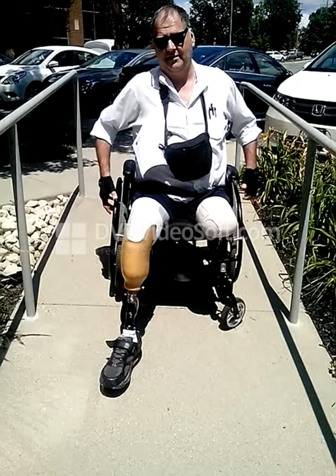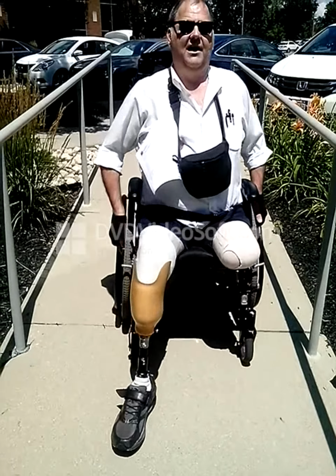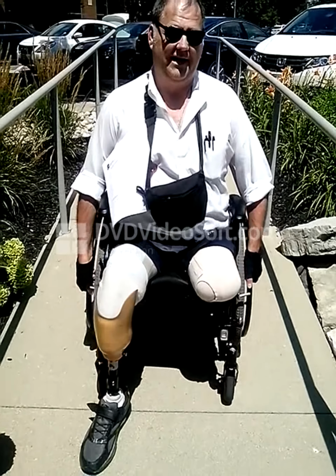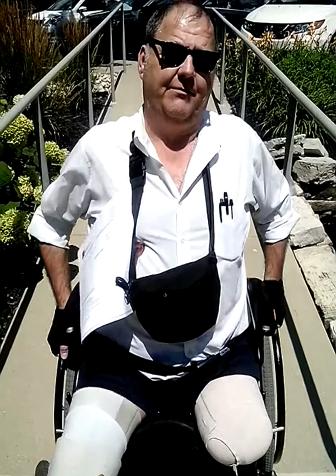I wouldn't rely on that to hold me on a ramp at all. But I can just go down the ramp simply like this. Now, one of the things I would never do is go down a ramp backwards, because it messes up your center of gravity. It'll be over my back wheels, and I have a really good chance of tipping myself over.